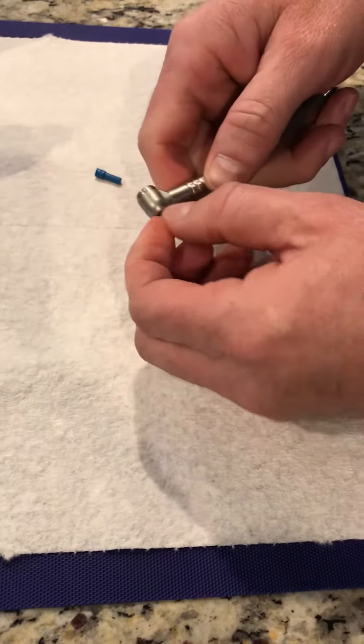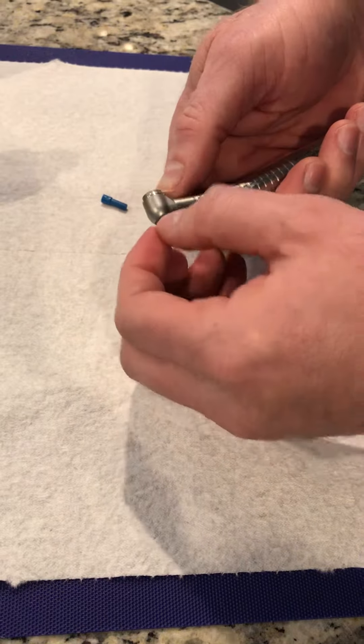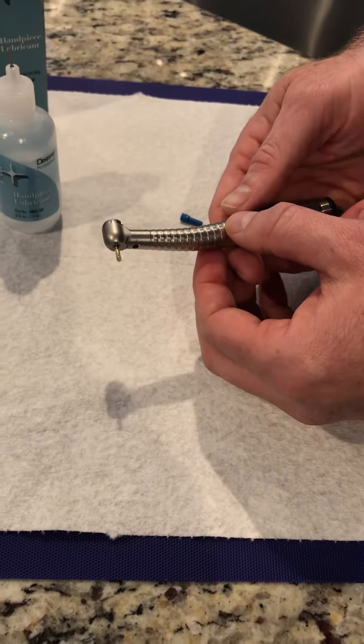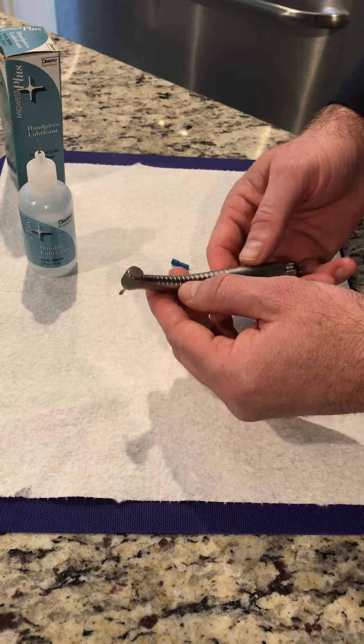Now that we have that mineral oil in there, spin that burr back and forth to work it around. Sometimes you can take it out, put a few more drops back in, then connect it to your tubing and run it for a while at your normal high-speed setting.